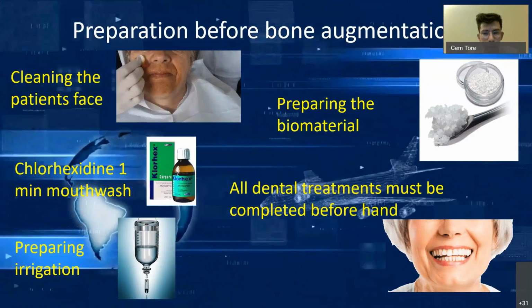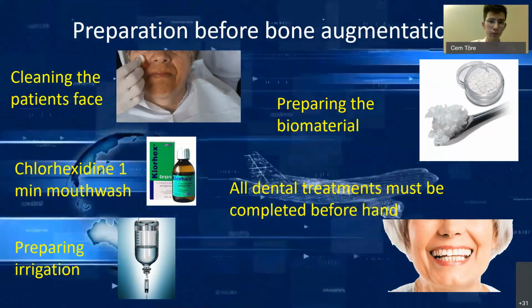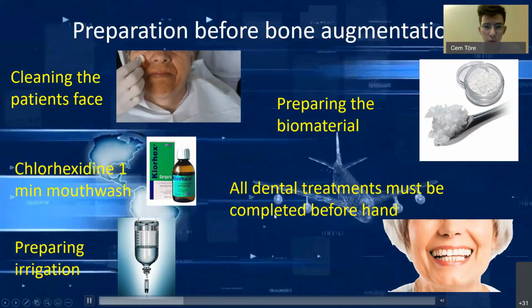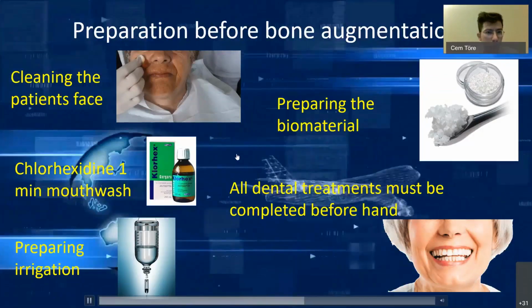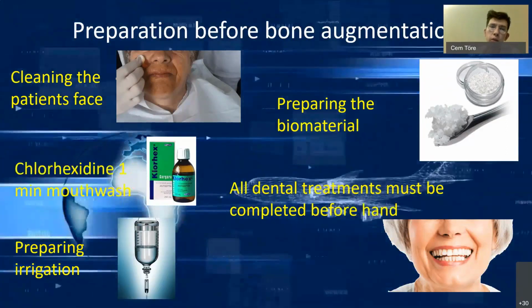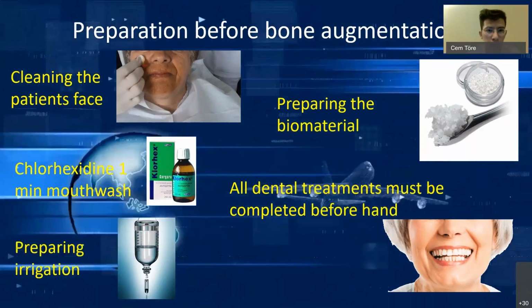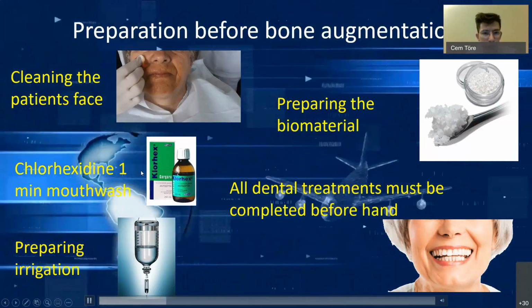You can remember at times when we are placing sutures, the excess of the suture goes around this area, and then when we pull on the suture, it just grazes this area. And then what you have there will basically be transferred to the place you are placing the suture. So if you clean that area, we don't need to worry about that happening. And we need a 1 minute mouthwash rinse with the chlorhexidine solution.